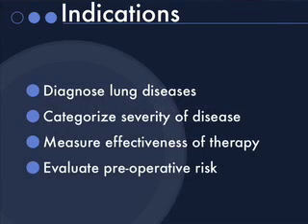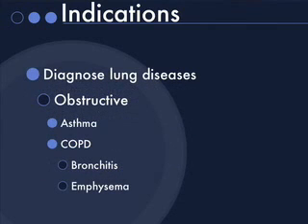The most common indications in a primary care setting for spirometry are to be able to diagnose lung diseases, categorize the severity of the disease, measure the effectiveness of therapy, and evaluate the preoperative risk. There are very limited things that you can diagnose with spirometry.